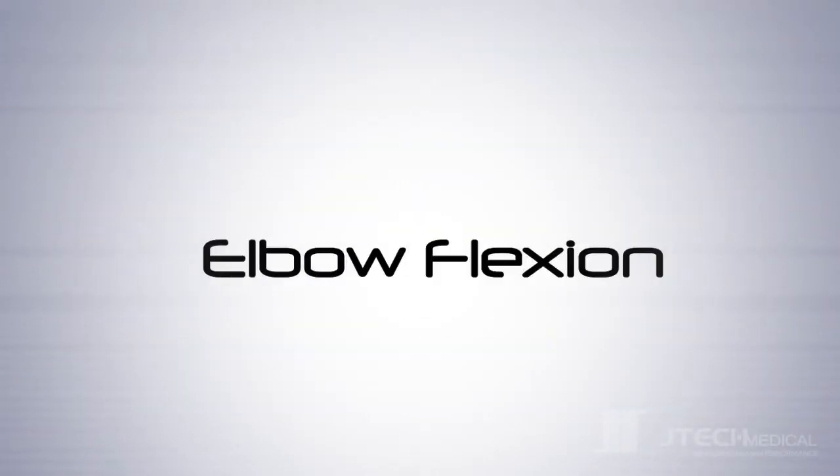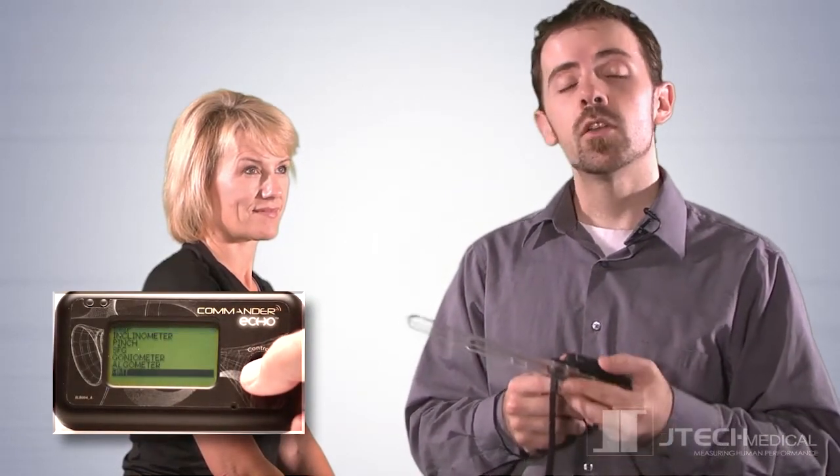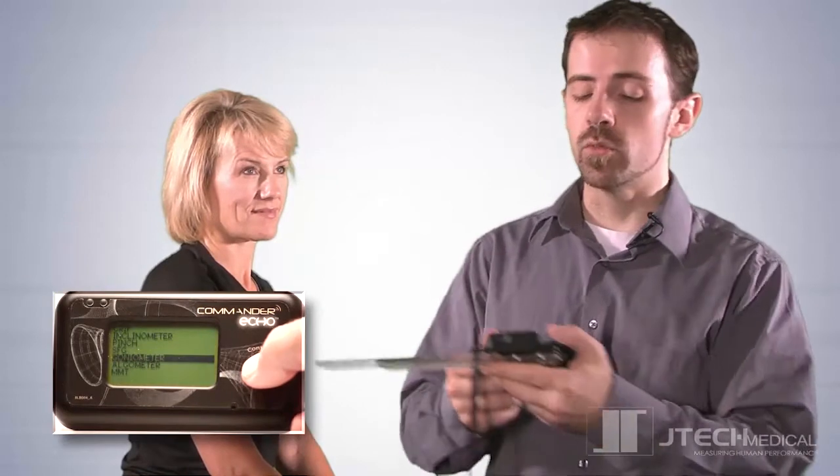Here's an example of the device in use. Once you've changed the desired options in the settings menu, return to the main menu, choose test, and select the goniometer instrument. You'll be prompted to activate the device, which you can do by pressing the on button.